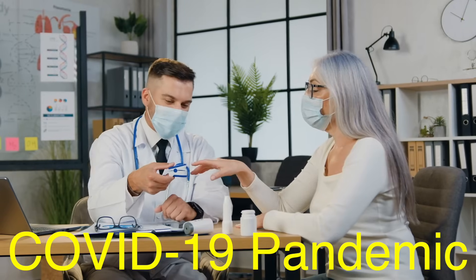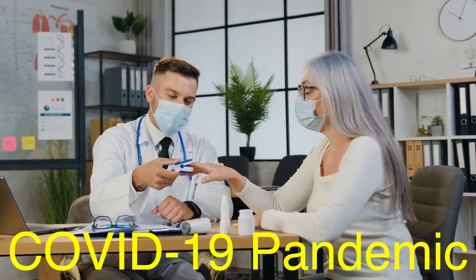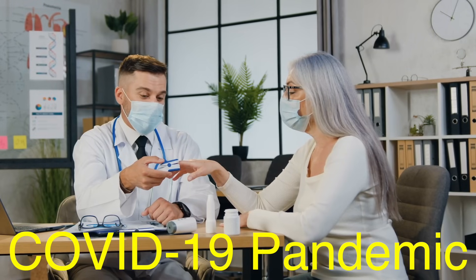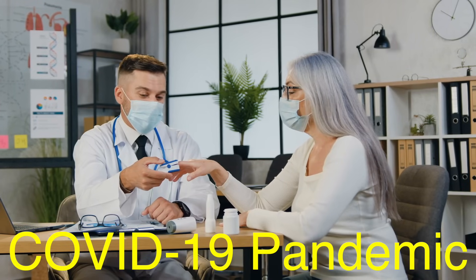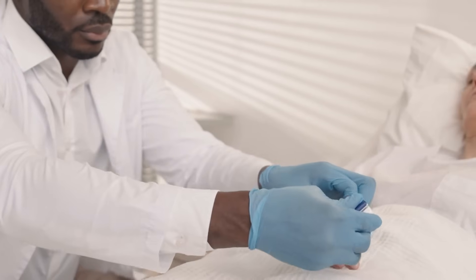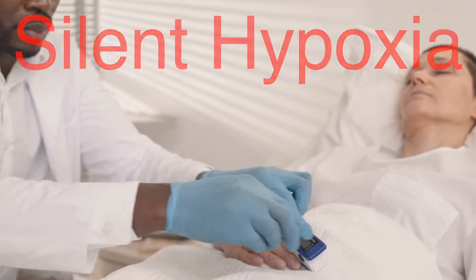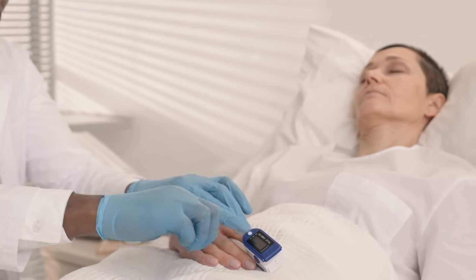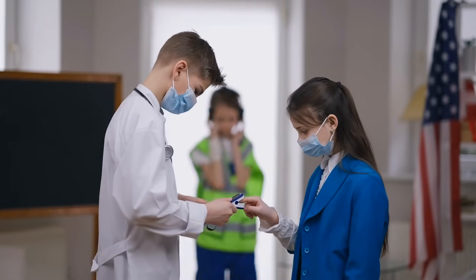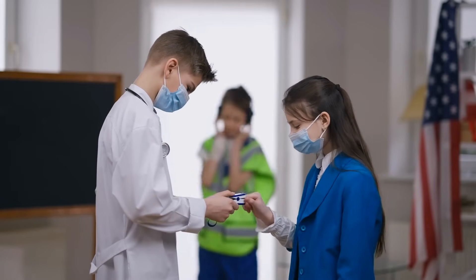The COVID-19 pandemic brought pulse oximeters into the spotlight. Low blood oxygen levels were one of the early warning signs of severe COVID-19 cases, even in patients who didn't feel short of breath. This phenomenon, called silent hypoxia, made pulse oximeters an essential tool for early detection and intervention. Their role during the pandemic underscored their value beyond traditional clinical settings.